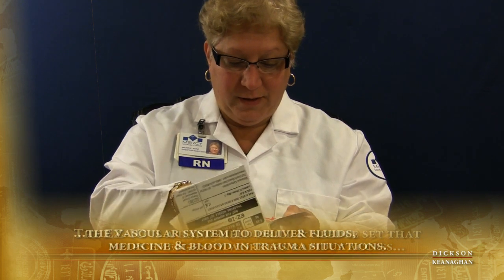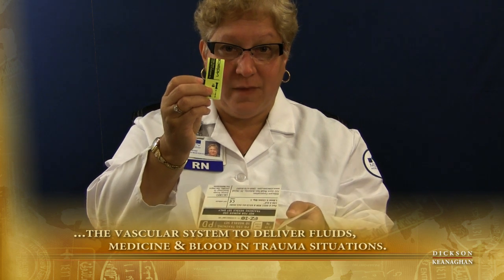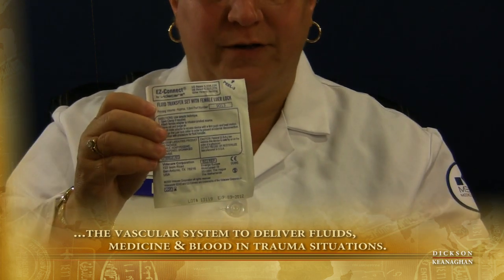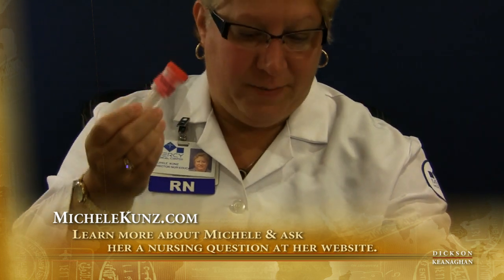So again, when I open the needle package, it comes with the handy dandy armband. It comes with the extension tubing, which I'll flush first. And it comes with a needle that's sterile in a package.